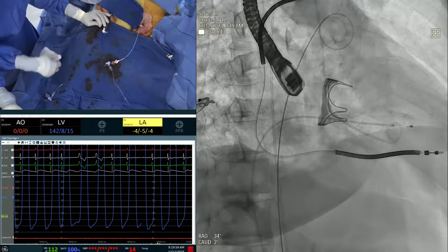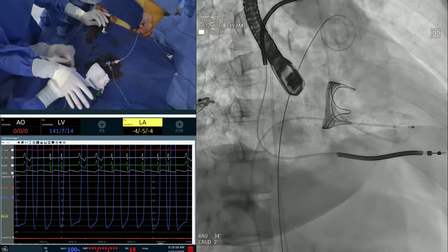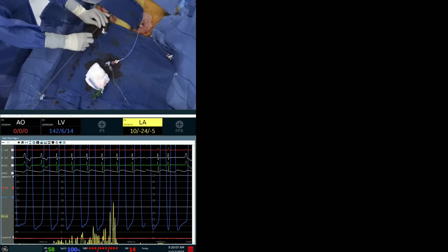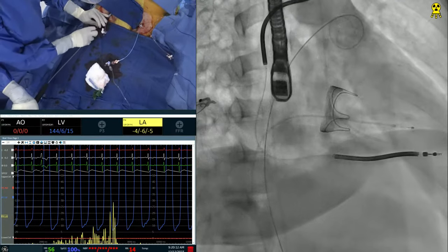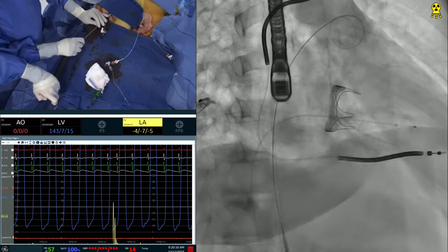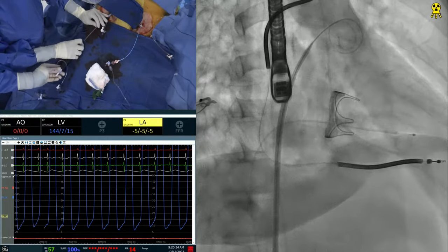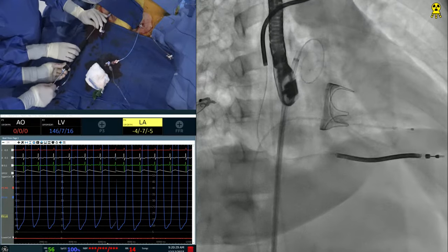So it's a deflectable sheath, Dr. Sharma. We're going to deliver it first, and then through it, we'll put a multipurpose and a crossing wire. So, is the mechanism predominantly MS or MR? No, MS. Degenerative MS. Yeah, so I think that also determines what wire we are going to use for crossing. For predominantly MS, we would use a straight stiff glide wire. And for MR lesions, we just go with a J wire. But it's only one leaflet, right? One leaflet is not moving. Good. Okay, now minimal MR.